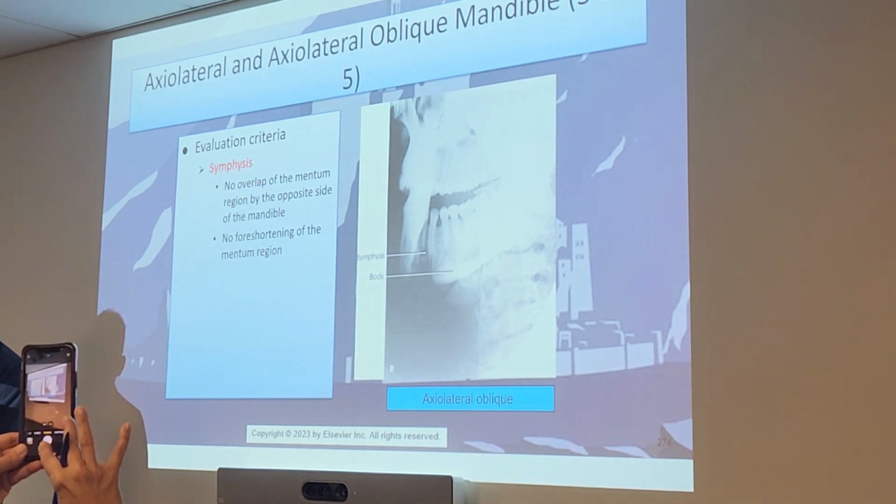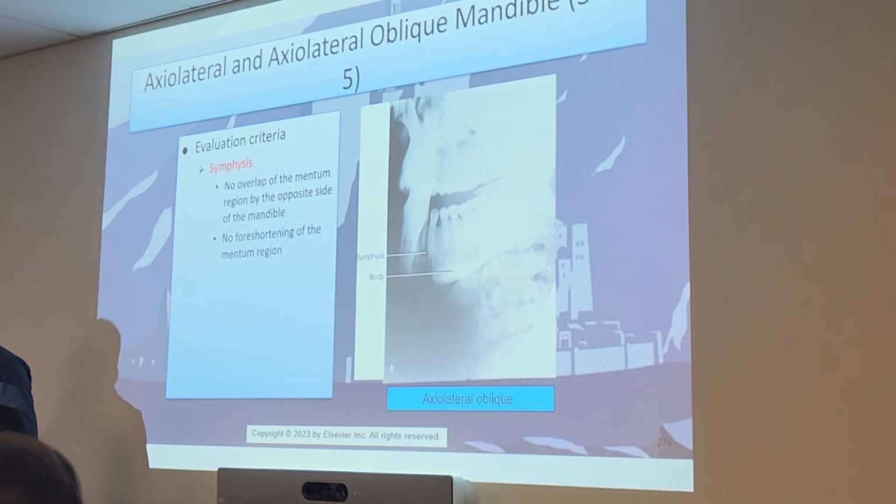Why didn't they just do a bilateral standing knee? Where was this at? Albany. It's probably just a protocol thing. It's just really what the doctor wants, honestly. You're like, well, would it be more efficient to do bilateral? Yeah, it would, but you're kind of at the mercy of what the doctor wants, unfortunately. So we wouldn't be able to change it.